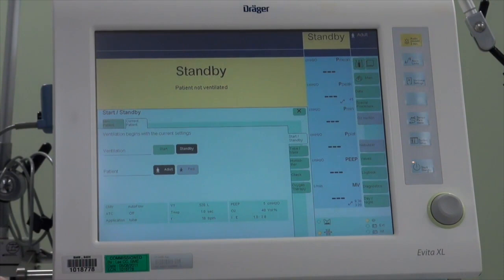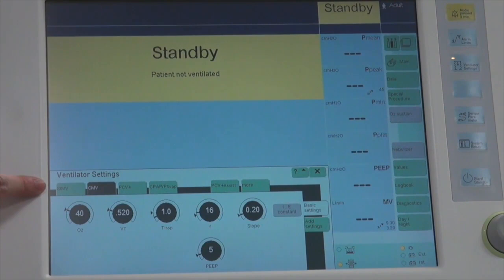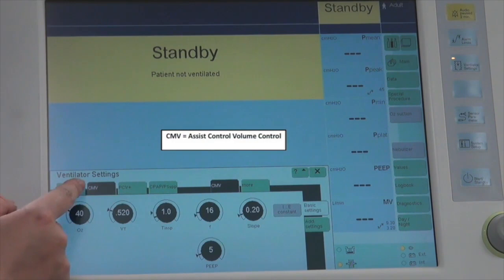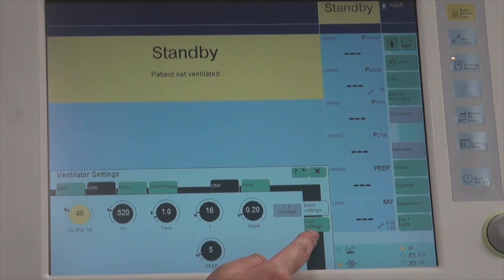After completing the device and circuit check, go on to set the ventilator settings. Go to Ventilator Settings — notice the modes are displayed in the tabs above. If a mode is not displayed, go to More to find additional modes. The first mode demonstrated is CMV. After CMV is selected, the settings shown are FiO2 (range from room air to 100%), tidal volume, inspiratory time, set rate, slope, and PEEP. These are the basic settings, with additional settings available on a separate tab.